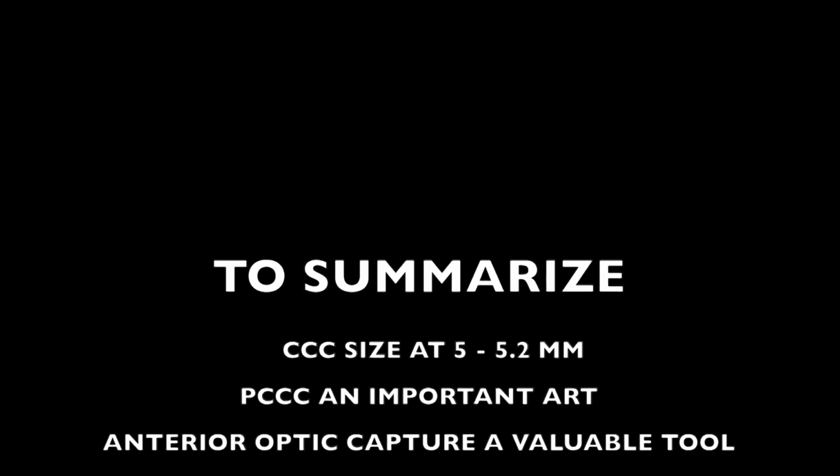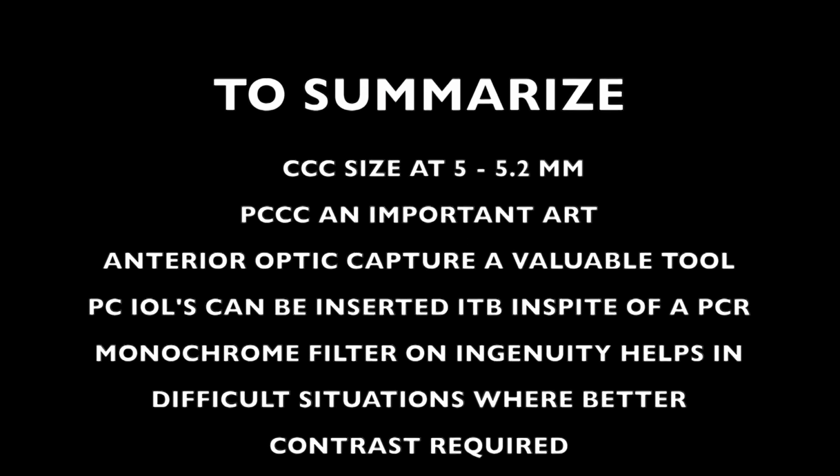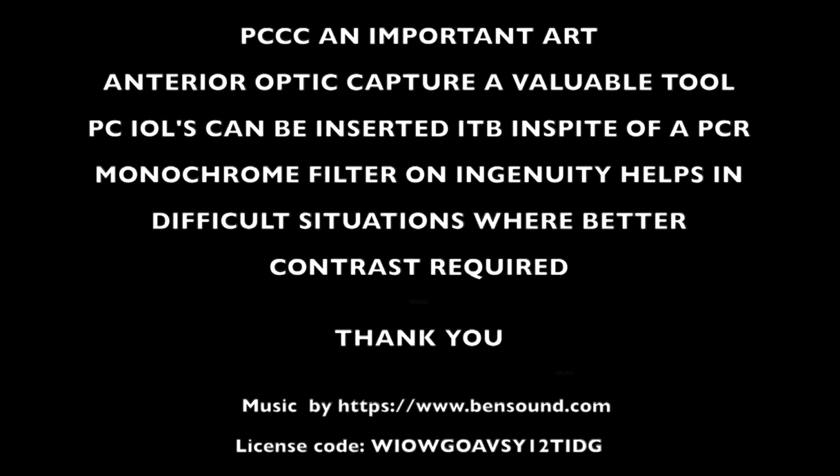So to summarize, we need to aim at a smaller CCC. PCCC is an important art, and anterior optic capture also is important in these kind of scenarios.